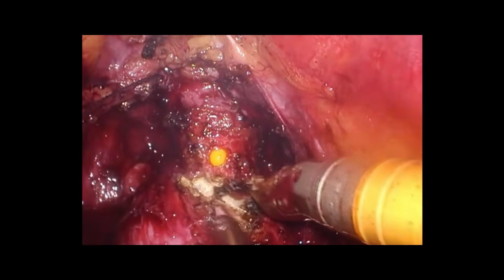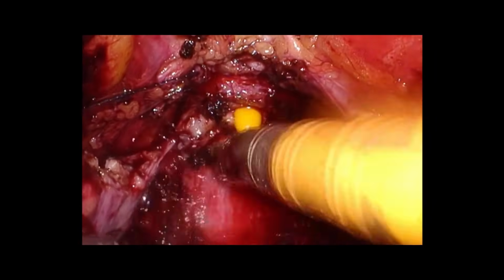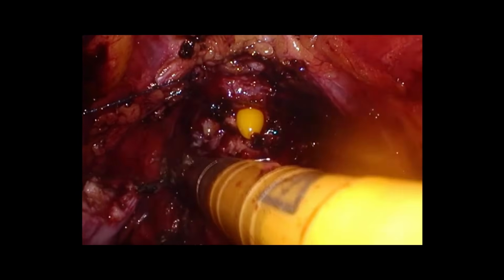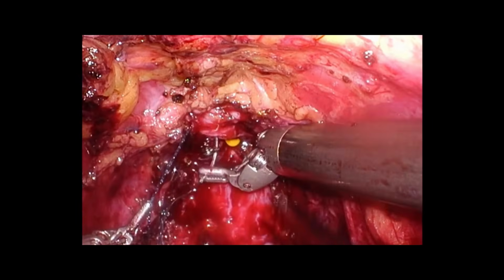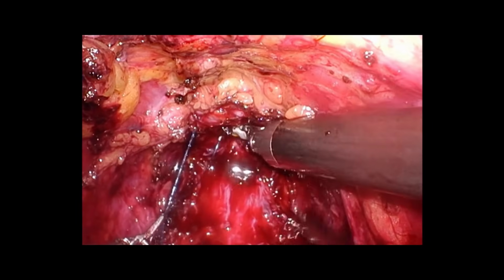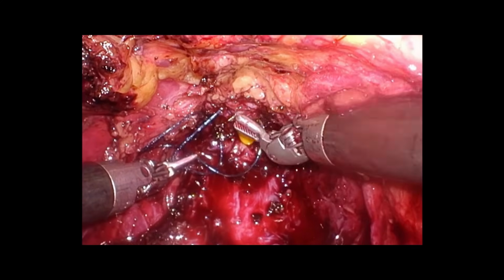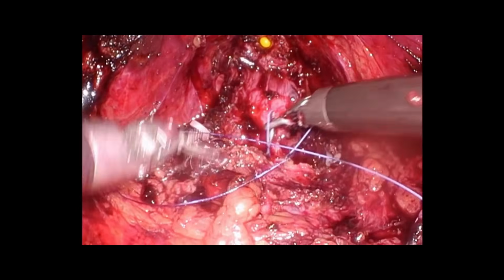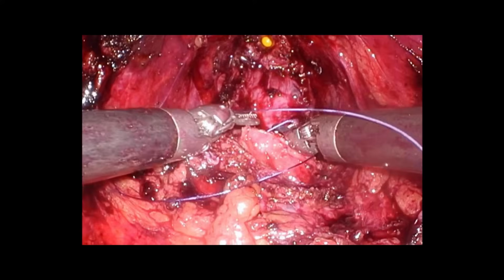It's a small prostate, so it's easy, but the only thing is it's a post-TURP case. You have a good length of intra-abdominal urethra. The completion of the DVC can be done if you keep the DVC stitch. Make sure that you take only the DVC, not the urethra along with that. Then bladder neck reconstruction is done.